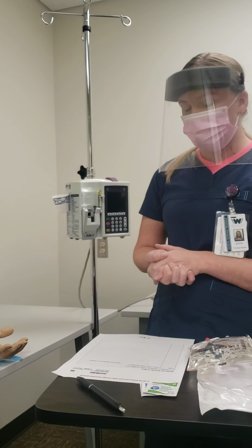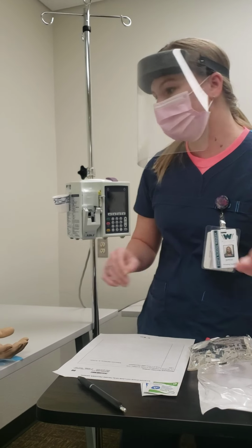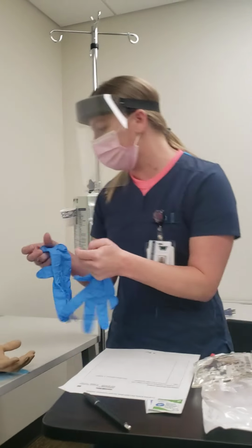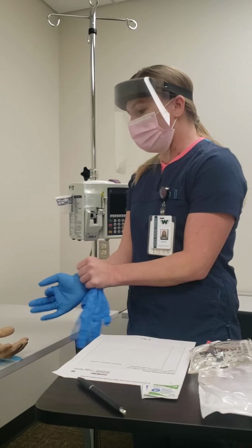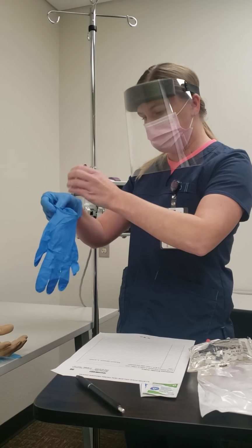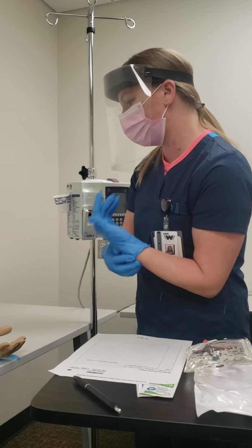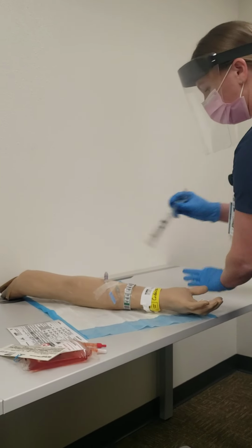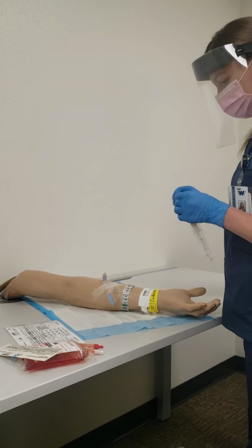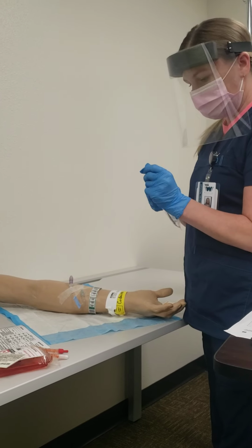And so now I will just go ahead and check her IV site and confirm that that is an 18 gauge needle, because I know I need that for her blood transfusion. And so I have flush, and so first I just assess the site, and I don't see that there's any swelling or tenderness or redness.